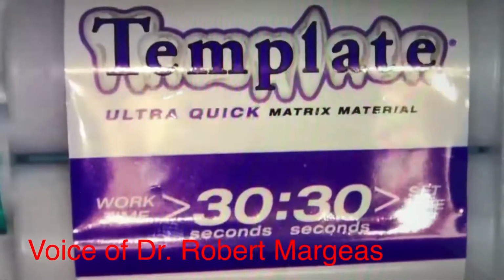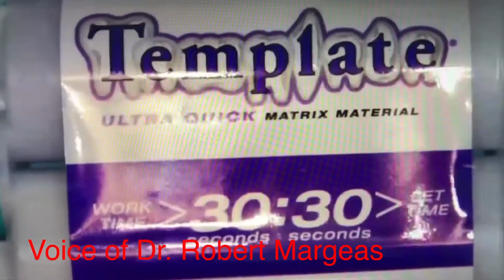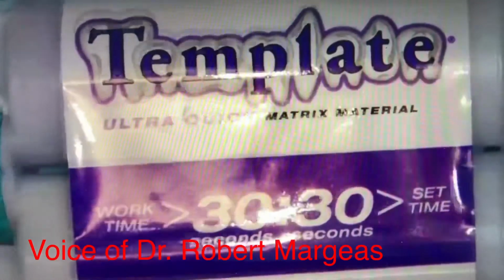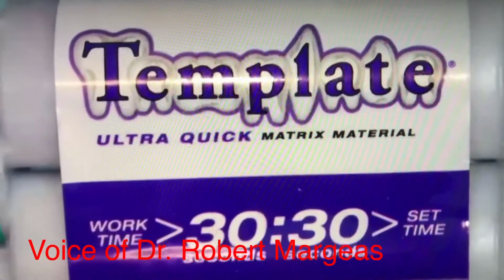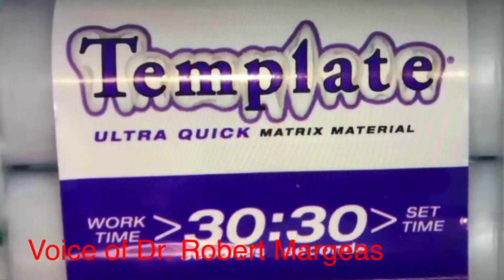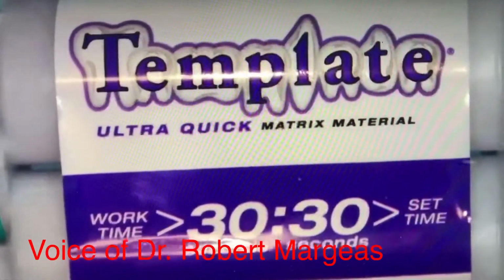Prior to prepping a tooth, I'll make a template matrix material in my temp tray, where I have the ability to put that in the patient's record, so that if they ever break a temporary, I already have that ready to go of their pre-op model.